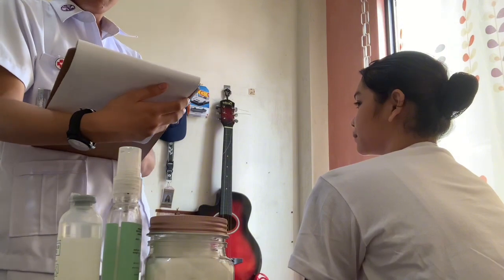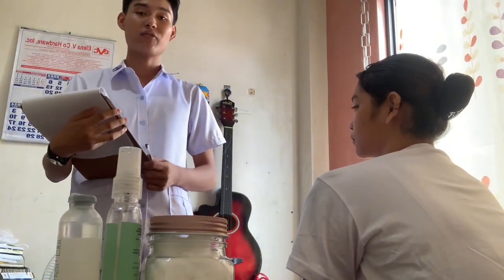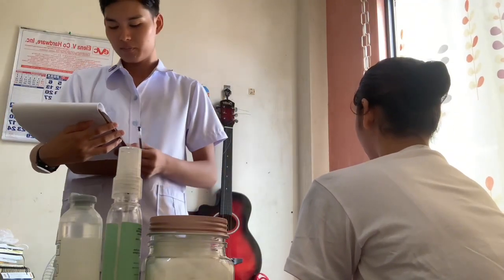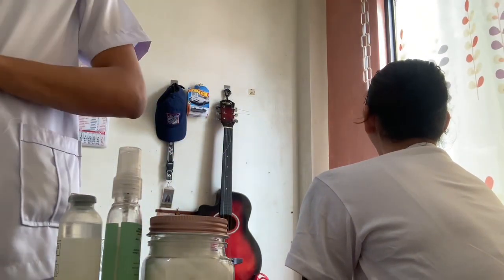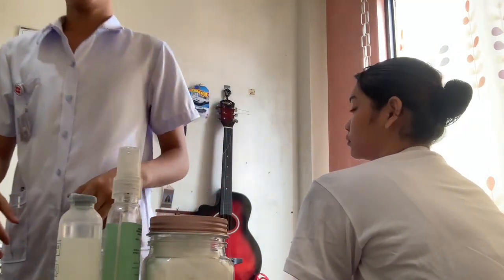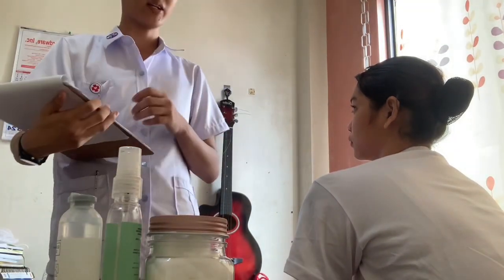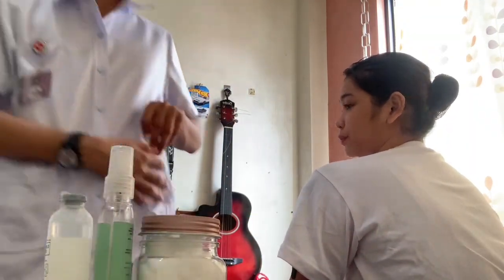Okay. So now for intramuscular injection, we need to select a site that is free of skin lesion, tenderness, or localized inflammation. Now, if injections are to be frequent, alternate sites, and also the site that we need to remember should be the exact site for the injection. Now, apply gloves.